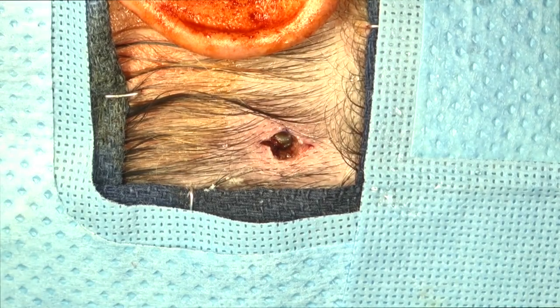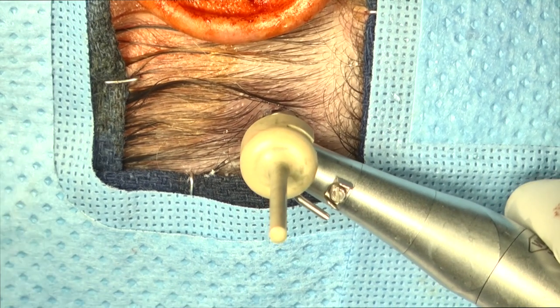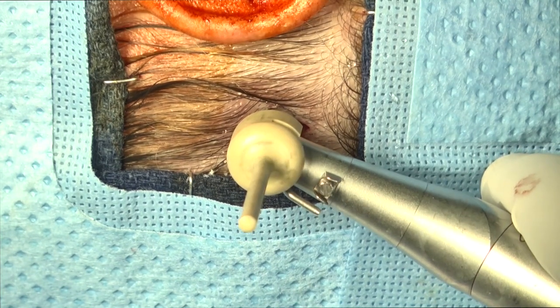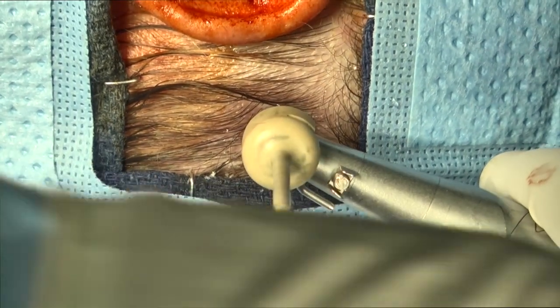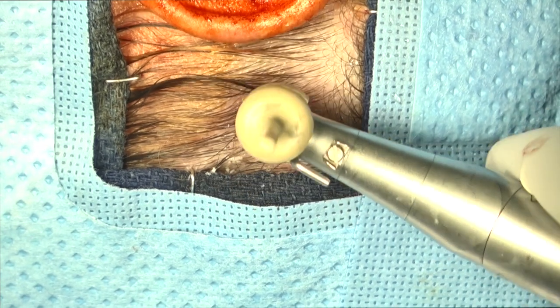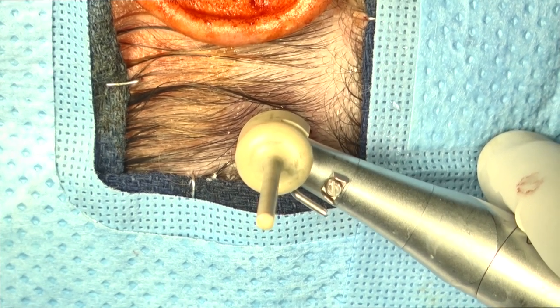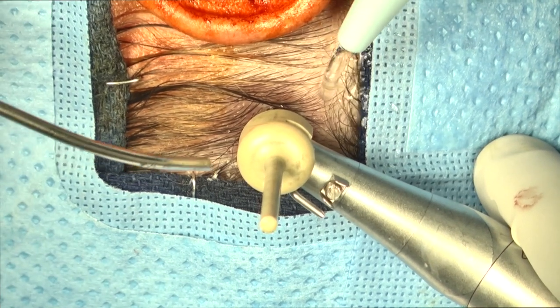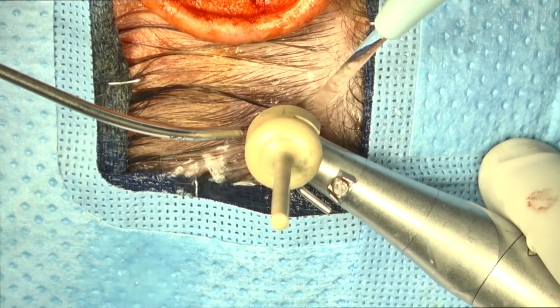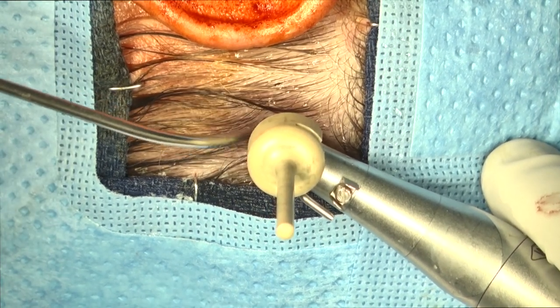In this particular case, a 4 millimeter countersink is being used. You will notice that there are two bevels or edges on the countersink drill. The first level of blades provides the total depth of the drilled hole, and the second level creates a very small bevel on the surface of the cortex of bone. Drilling should proceed until the second level of blades engages the cortex of the bone. It is critical that the drill hole is placed as perpendicular as possible to the surrounding skin. Drilling is performed with constant irrigation at a setting of 2,000 RPM for the countersink drill.